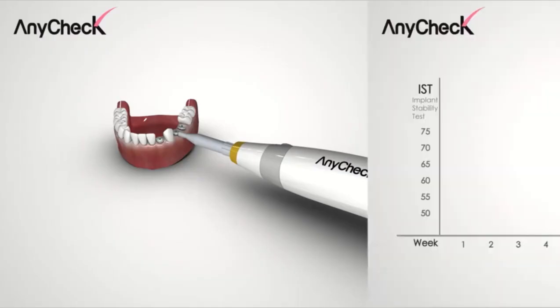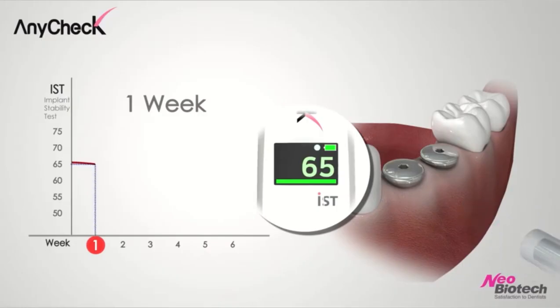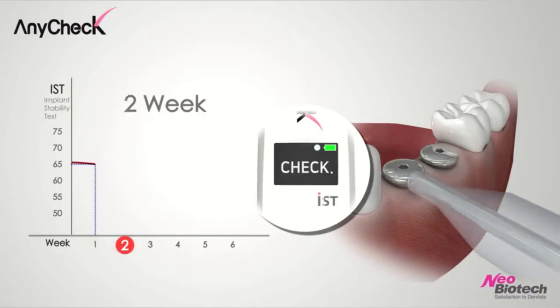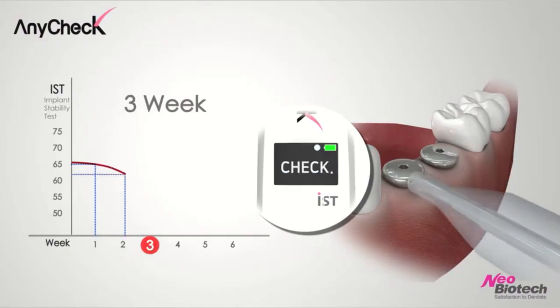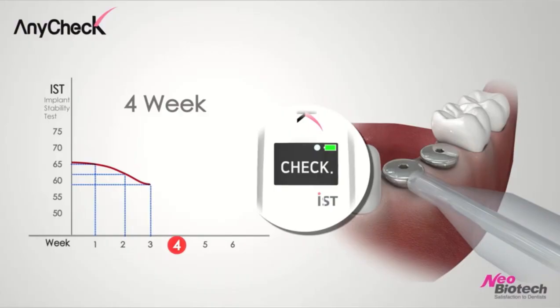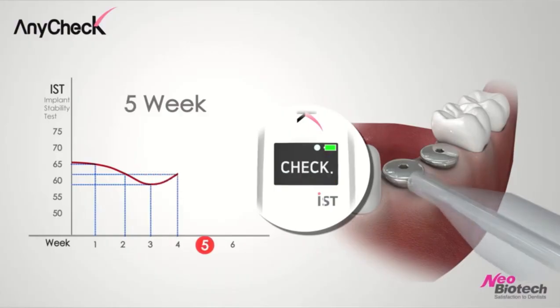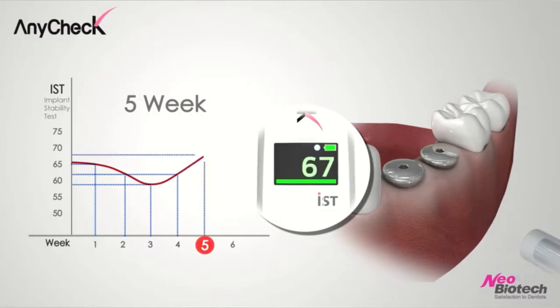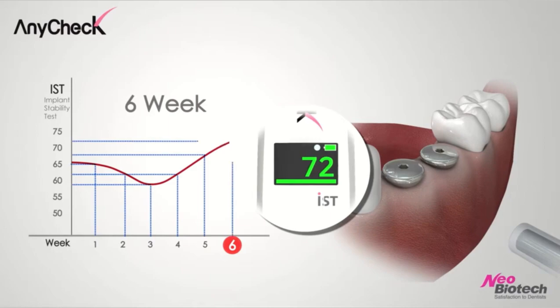The main benefit of using damping capacity is that there is no need for disconnection of the healing abutment between checking. So you can use it in the first week, second week, third week, and anytime you can check your implant stability. Of course, you can't do this when we use SmartPegs, as the disconnection in the second and third week is very dangerous and can interfere with the normal healing phase of your fixture.